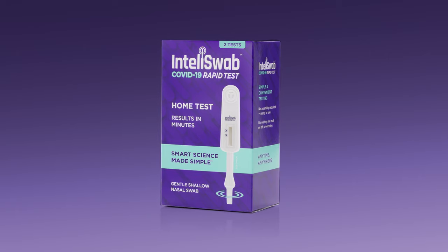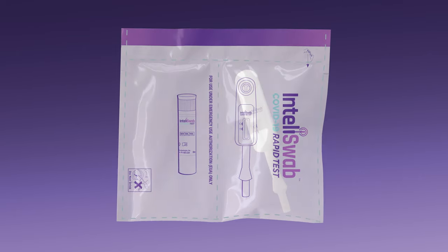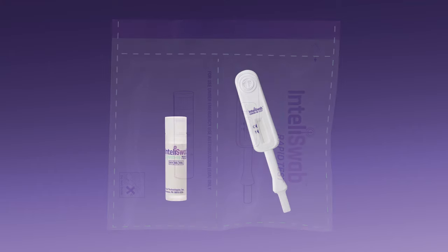Inside the IntelliSwab kit, you'll find two sealed foil pouches. Each foil pouch contains one test device and one tube.